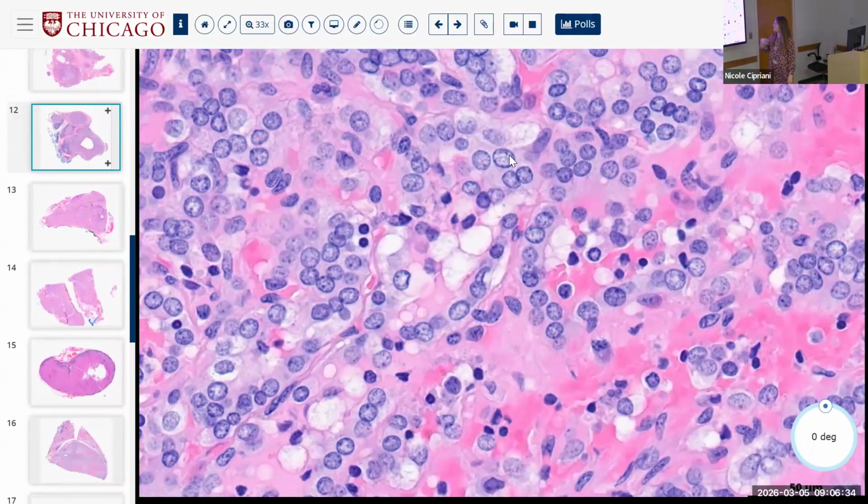But I am of the opinion that the NTRK tumors are also not PTC. There's something else. They're fusion tumors, right? You cannot tell me that this follows what we normally think about of the nuclear pattern of PTC, right? It just doesn't. It's a thyroid carcinoma, yes, but the fusion ones are different. There's the RAS things, there's the BRAF things, and there's the fusion things.